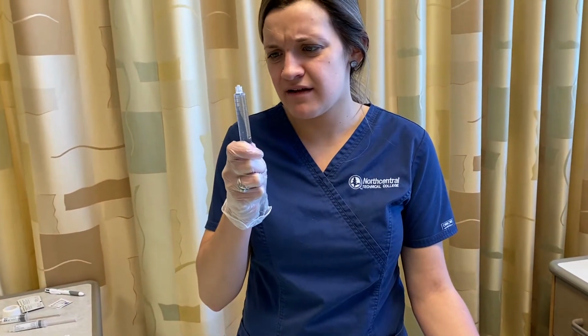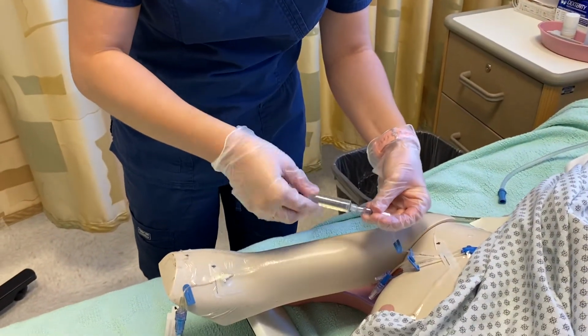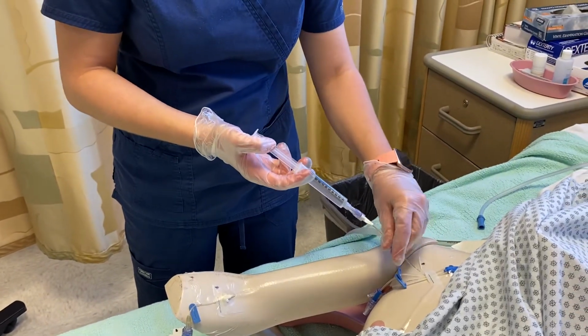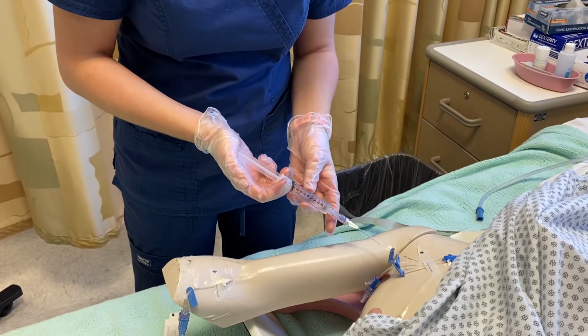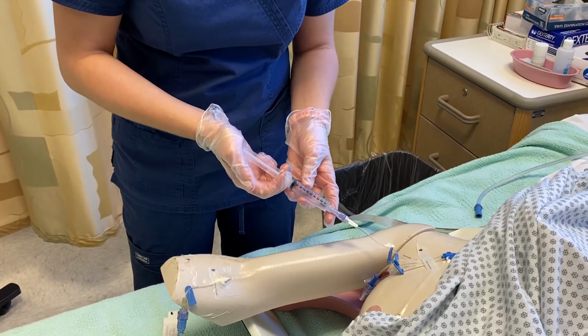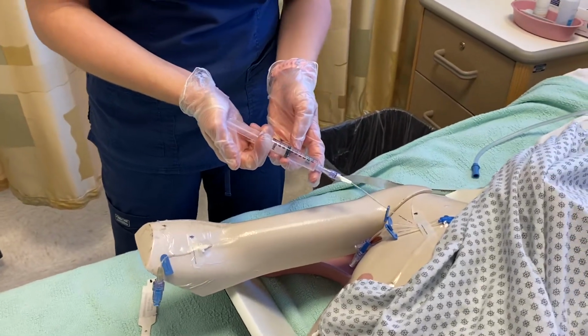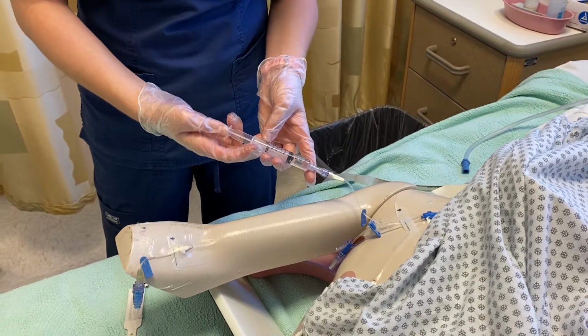I'm going to get any air that I might have out. I'm going to attach that. And we're just going to do this first flush, and remove the clamp as well. First flush to make sure the line is patent and that it goes through just fine. And you give this however fast your facility protocol says for.